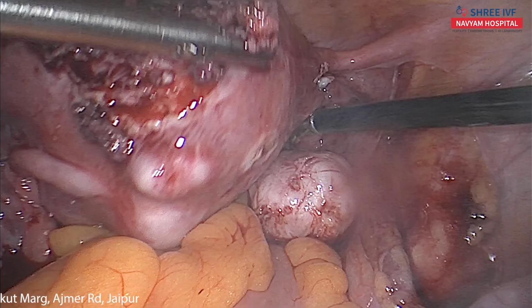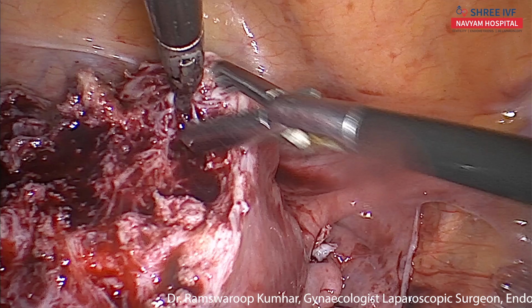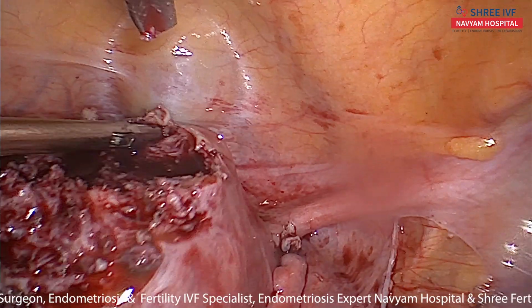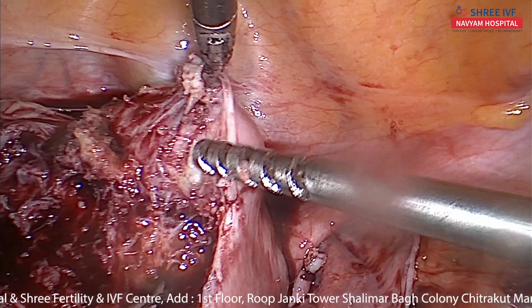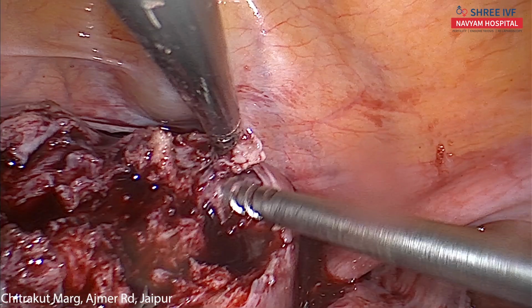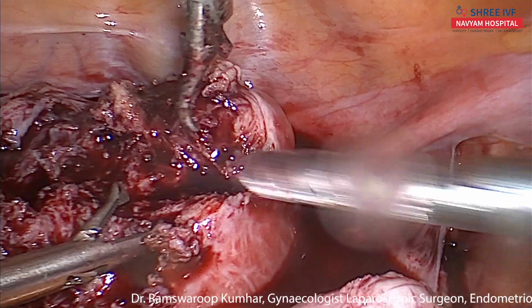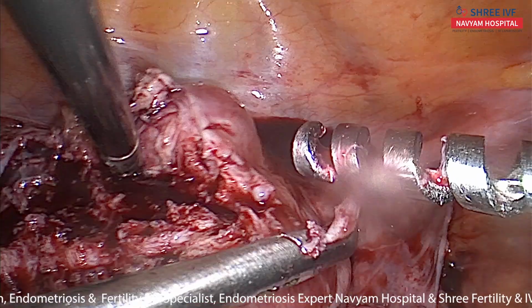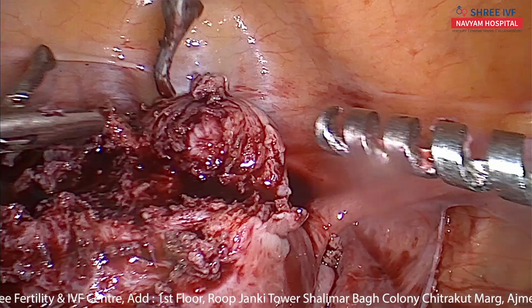This is specimen number 4. The tissue is a little adenomyotic. The tissue is breaking, not getting hold.